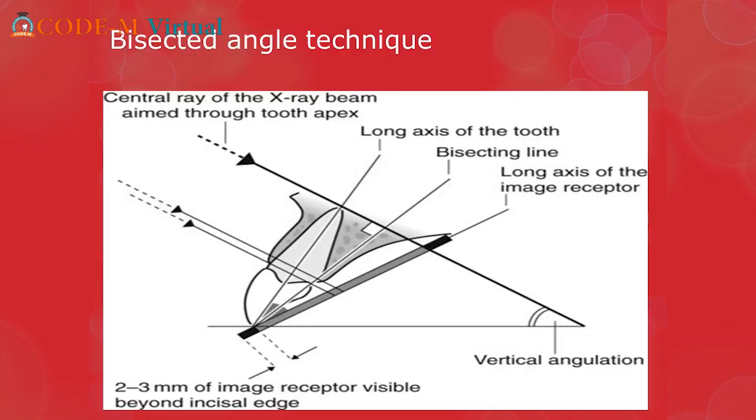Now, this is the image showing the bisected angle technique. So how we are going to place the X-ray and how we are going to use the X-ray beam for taking a bisected angle technique radiograph.